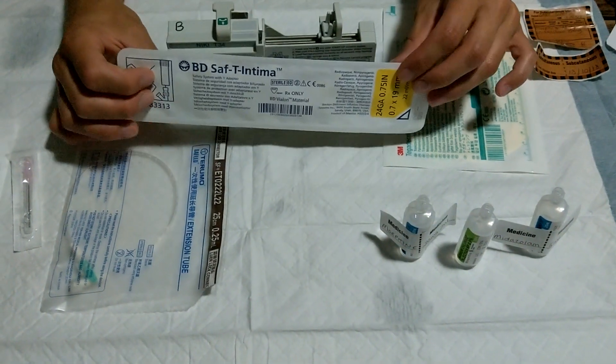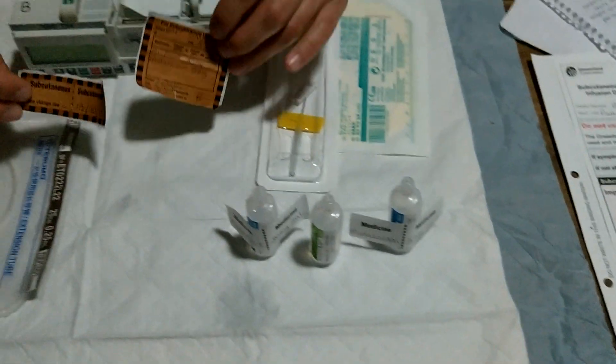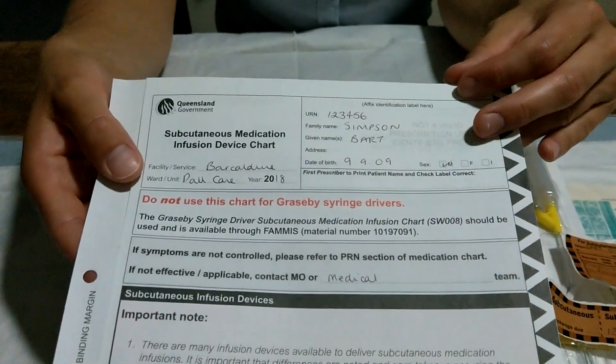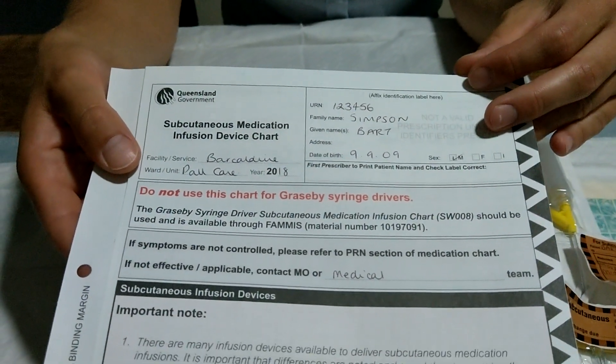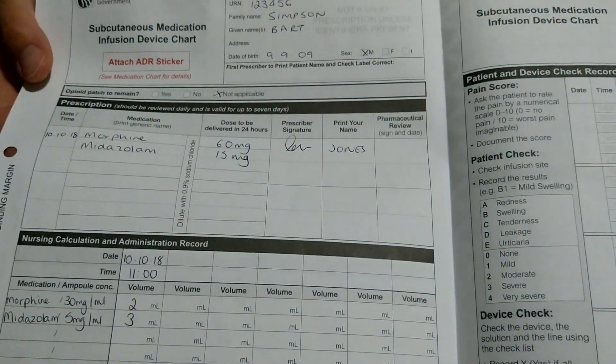Then you need your medications, a subcutaneous line into the patient if they don't already have one with an occlusive dressing. You then, of course, need to label both your syringe and the line. And last but not least, your subcutaneous medication infusion device chart, which will tell you what goes in it as well as your observations.